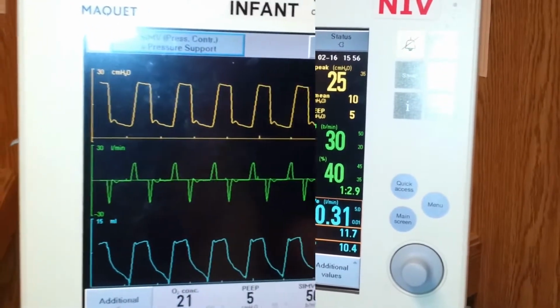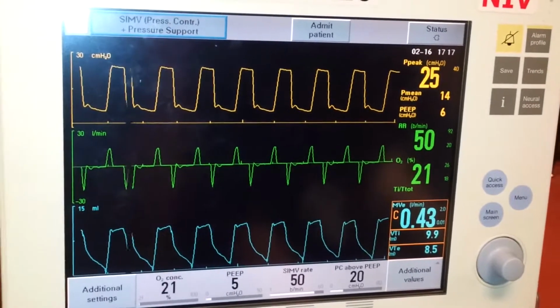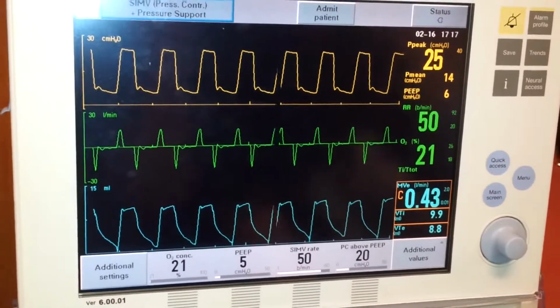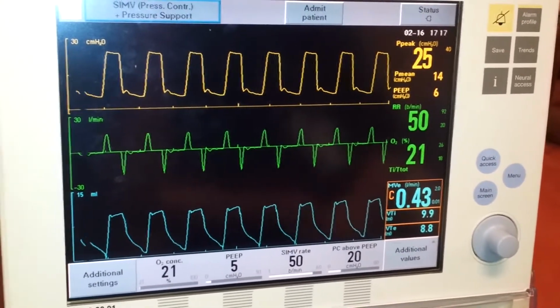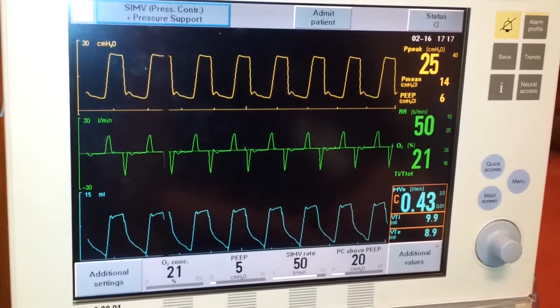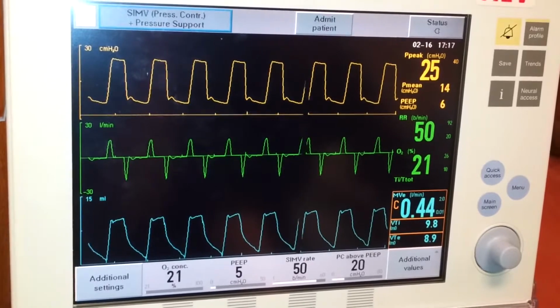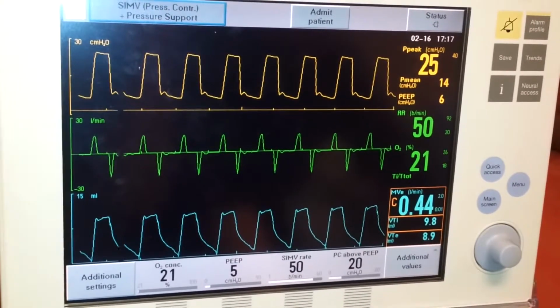So the first step to the CBO is circuiting the ventilator and the pre-use check. You will be expected to fully circuit the ventilator, including the humidifier, neonatal circuit, temperature probes. You'll also need a sterile water bag, your vent sheet, and endotracheal tube connector. You'll also be expected to go through the pre-use check. We're not going to go through that in this video though.